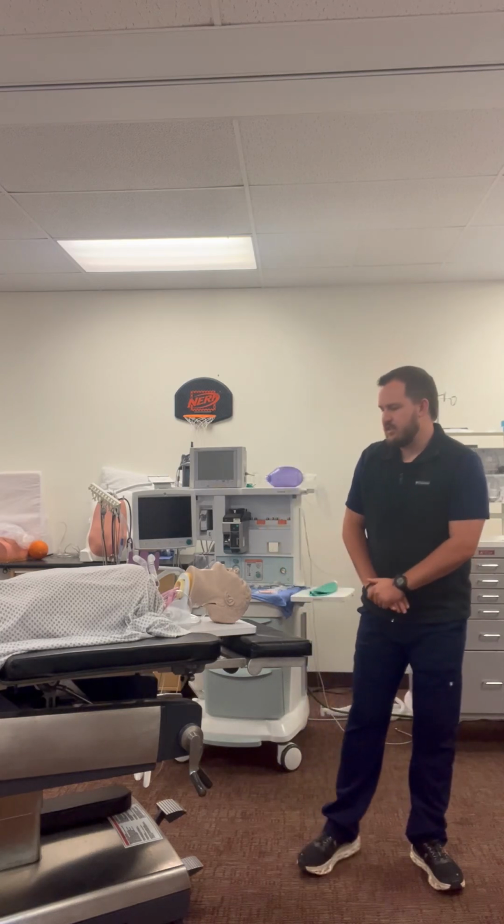Hi, my name's Jake. I'm going to be demonstrating a pediatric mask induction and intubation. The patient that I have today is a 5-year-old male. He weighs 20 kilograms and he is here for a tonsillectomy. The only significant medical history he has is some OSA, and that's related to enlarged tonsils.